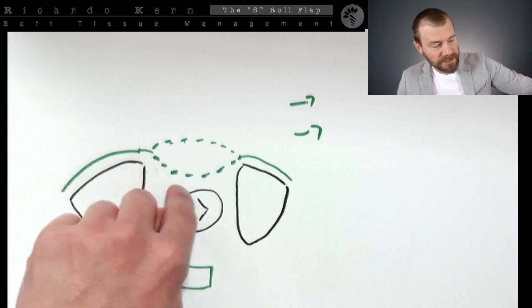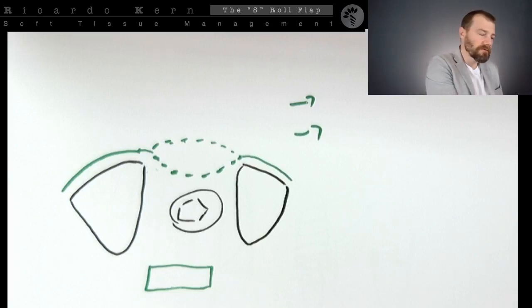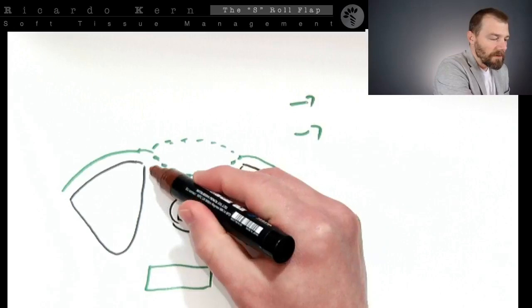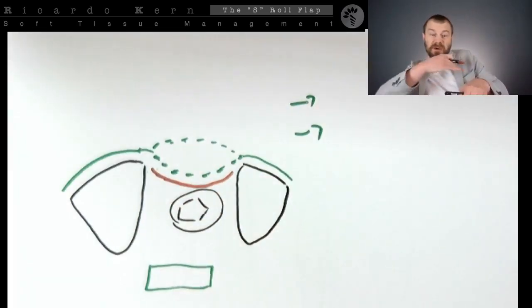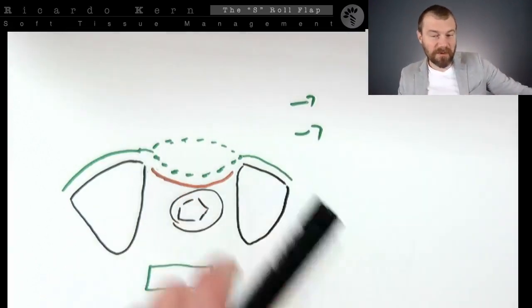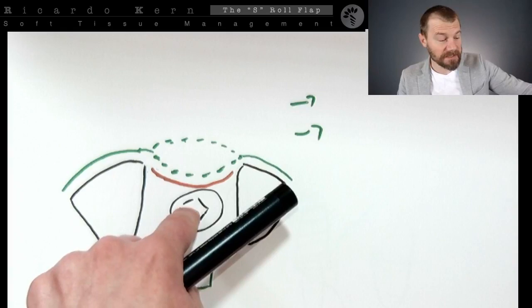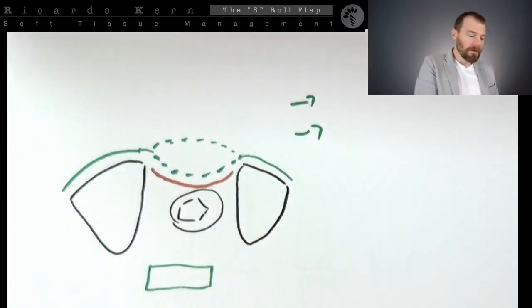If you detach this tissue from the ground with an incision that you can do through the sulcus of the crown that was once here that you remove, and you're going to do this incision here close to the bone. Sometimes you scrape on the bone, sometimes you scrape on the threads of the implant, and so on. Once you have this part free from the ground, look at that.